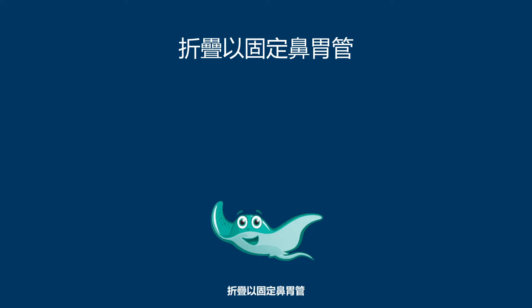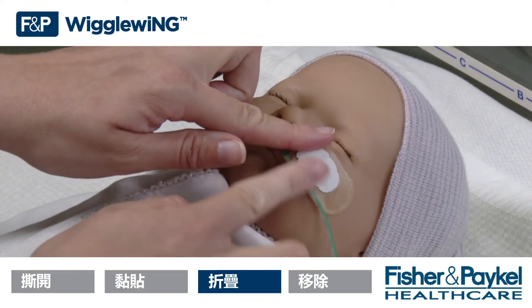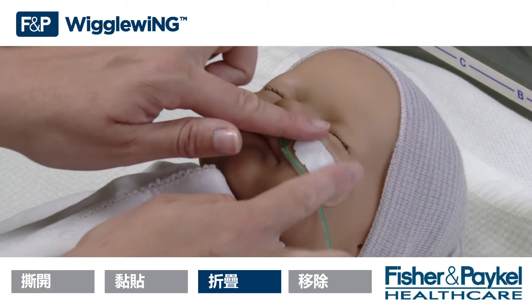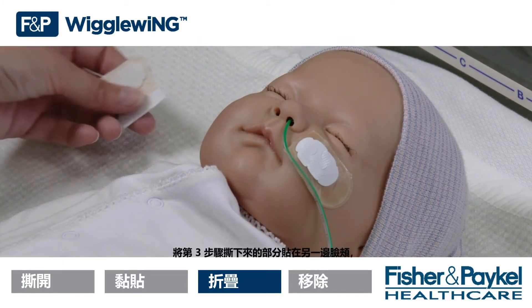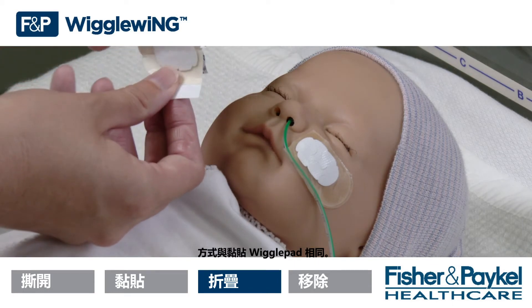Fold to secure the NG tube. Fold the FMP Wiggle Wing over to secure the NG tube. Apply the section removed in step 3 as you would a wiggle pad on the opposite cheek.